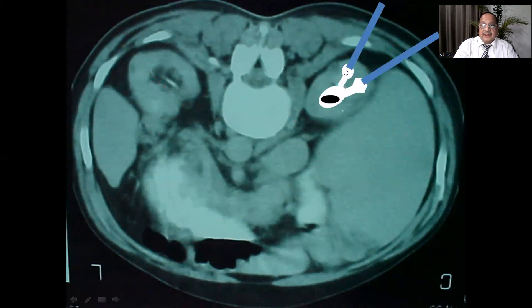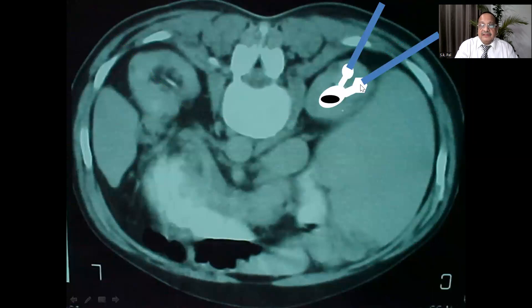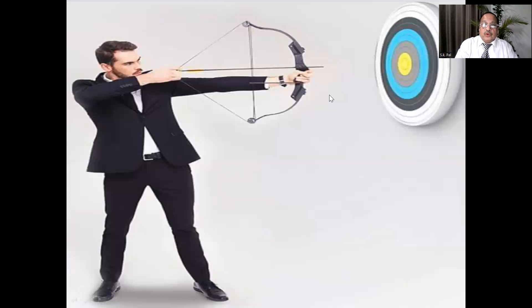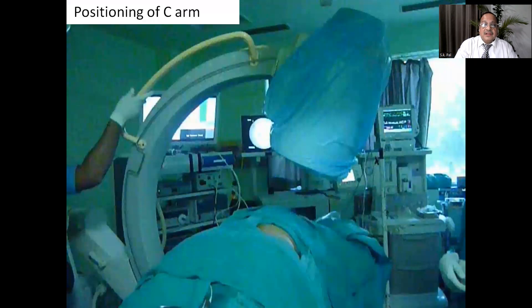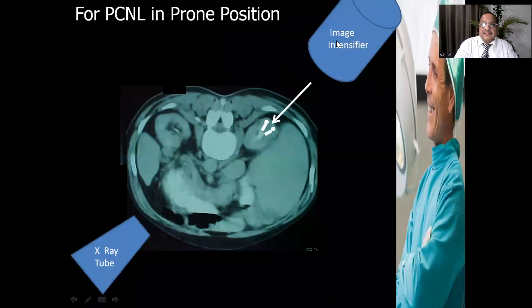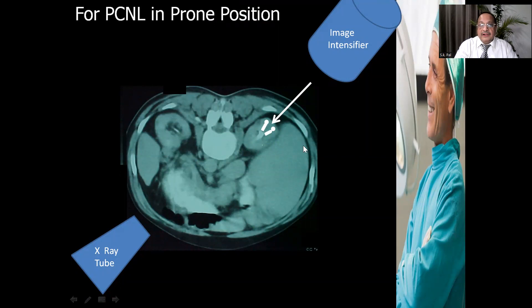These are our targets where we have to make a puncture. This is the posterior calyx, this is the anterior calyx through which we have to enter the pelvicalyceal system to remove this renal pelvic stone. Once you have identified your target, you should see the target straight on its face.